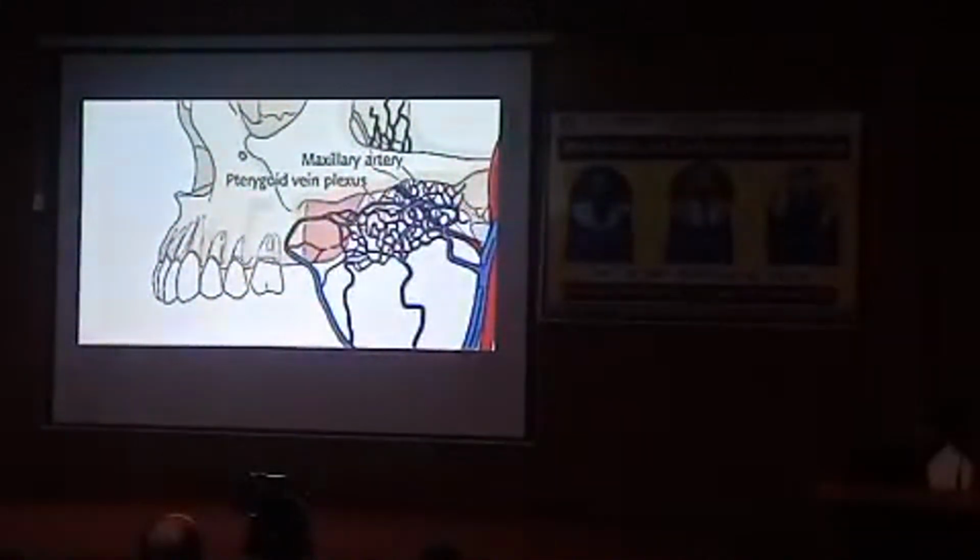So that is why next we will learn the very main thing. Be alert. If you haven't heard about implant placement until now, you will learn it. For pterygoid implant placement, you need to learn two angles: the vertical angle and the horizontal angle, which is also the buccopalatal angle. The vertical angle we can call the coronal angle, like how much occlusal tilt you have to give while doing this.